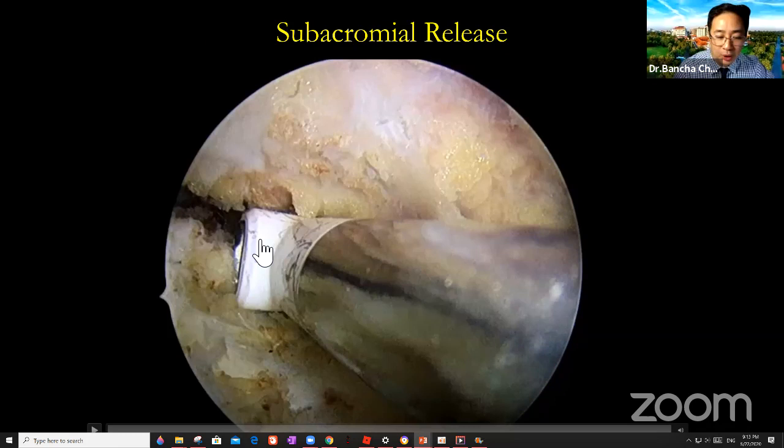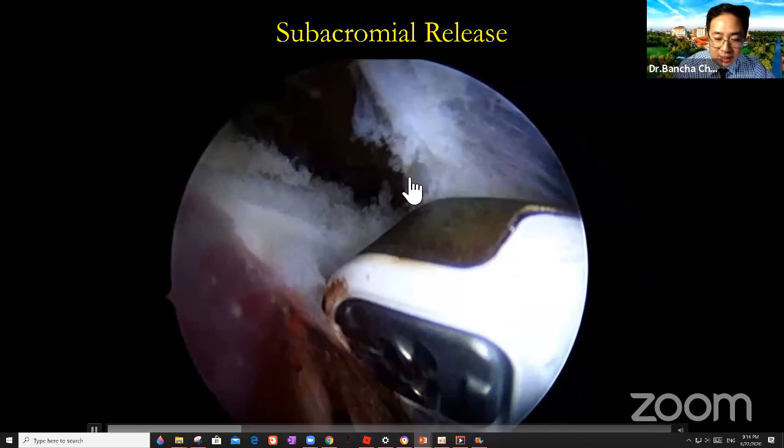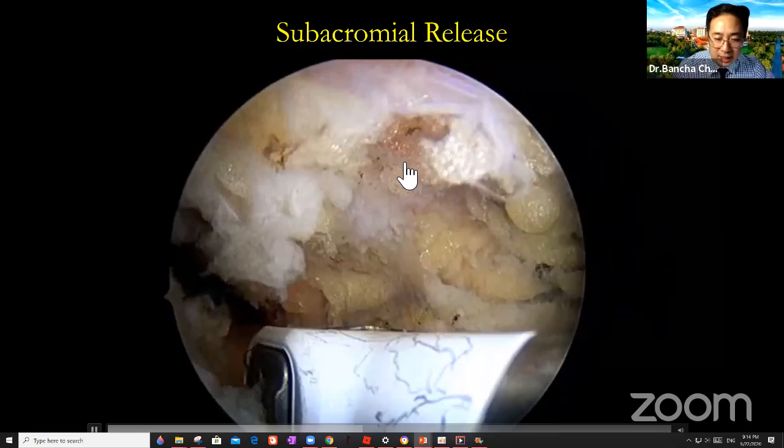And then we do the cleaning in the subacromial space. Remove all the bursal tissue. I think exposure is the key. On the right side, this is the conjoint tendon, and this is the coracoid process. So this is the AC joint, with cleaning.